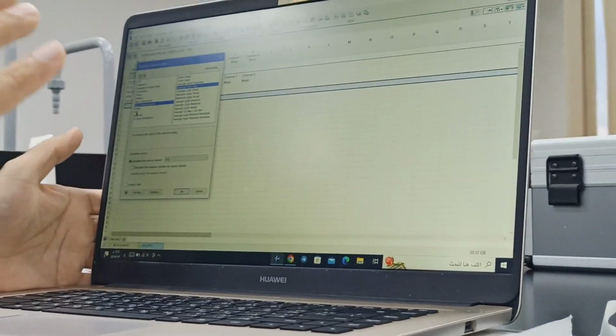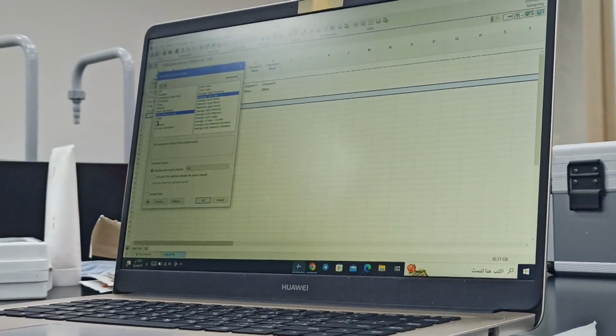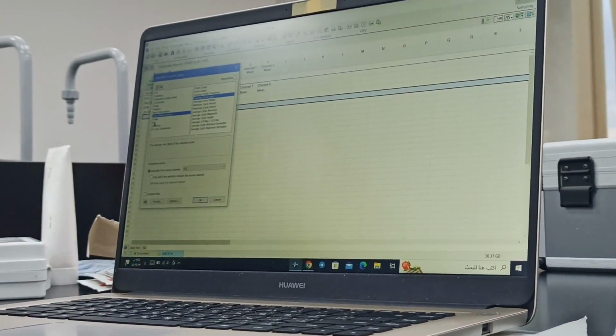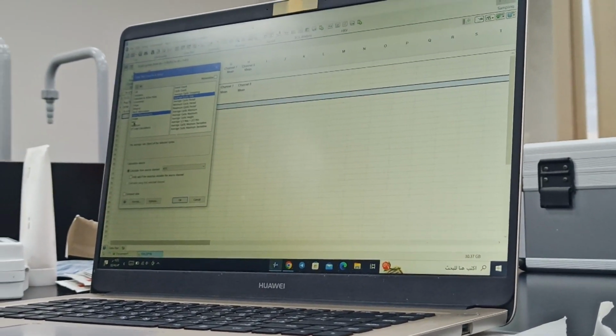Now we have to configure a file where we want HRV calculations to be automatically put into this file. We don't have to type. This is our purpose now. So for that we need many items. Number one is which is the section which we are recording.